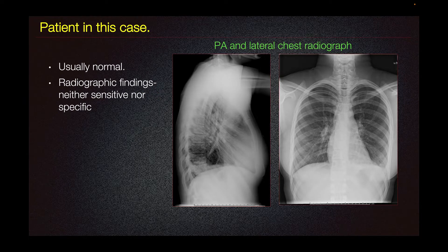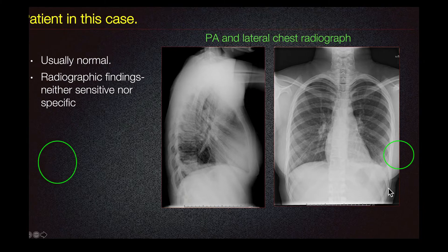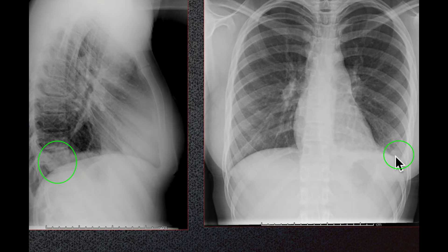The patient in this case presented with this PA and lateral chest radiograph. In patients with pulmonary embolism, radiographs are usually normal. There are described radiographic findings that are neither sensitive nor specific. The patient's radiograph demonstrates blunting of the left costophrenic angle, which is nonspecific and may represent small atelectasis or pleural effusion.